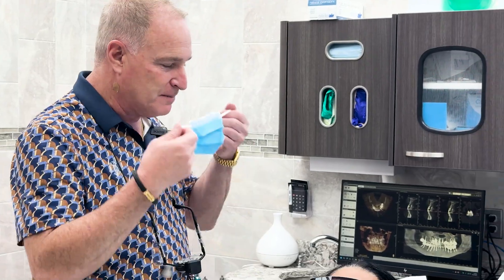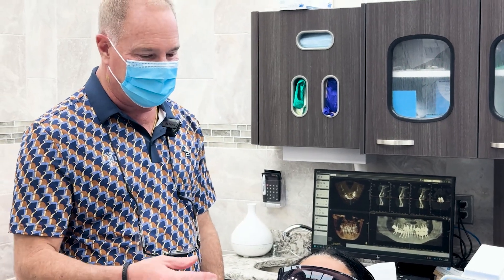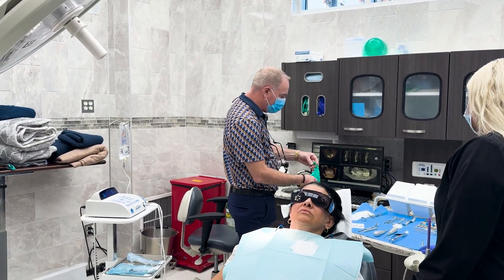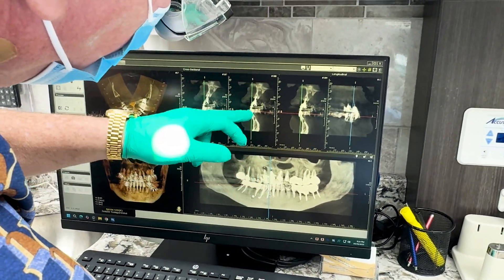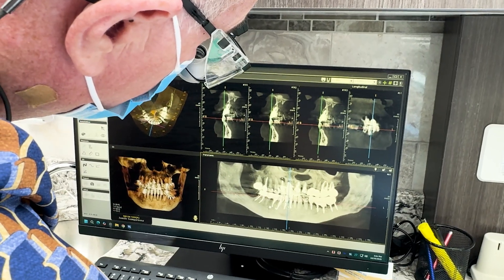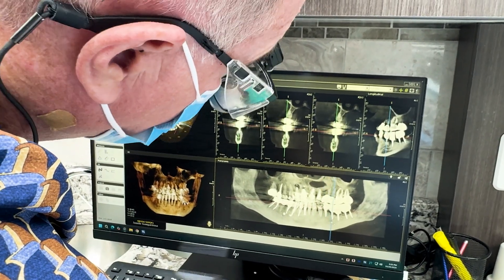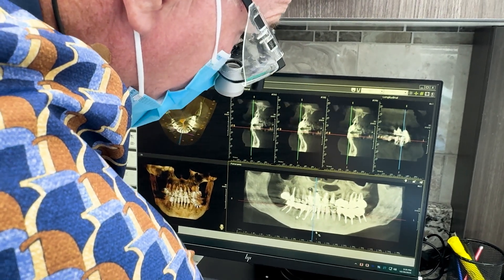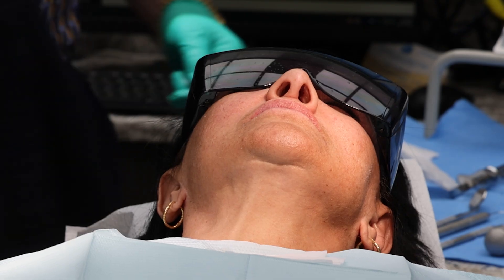I've done a lot of work on Jamil over the years — she's got many mini implants and has had a lot of other dental work. Unfortunately it's come to a point where number seven and eight have got to be lost. They're old root canal teeth that are just failing. You can see there's a large abscess on number seven and number eight, and there's actually a crack in the root canal on number eight, internal resorption, and apical pathology on both of those. You can see on the bottom left she's got mini implants that are doing just fine — been in for many, many years. She's had a lot of root canals in her mouth, a lot of dental work, but we're going to get rid of those two infected teeth.